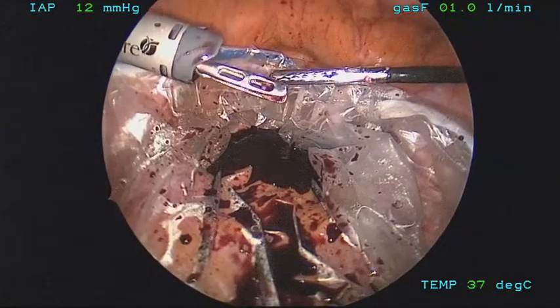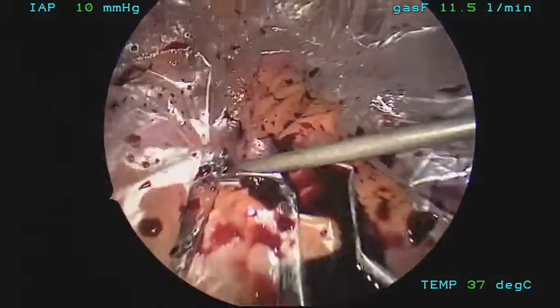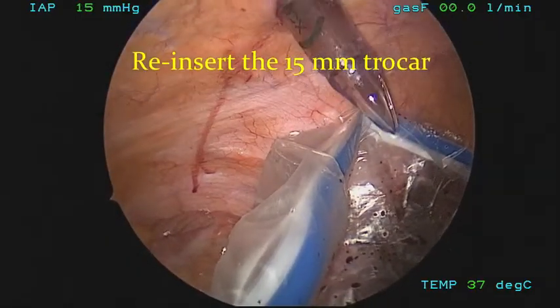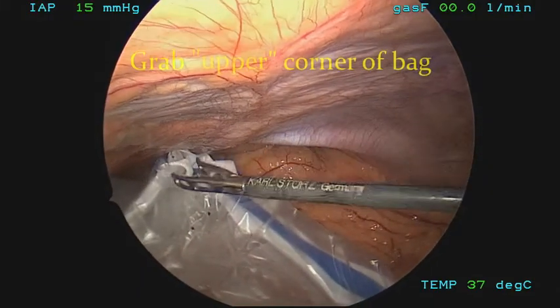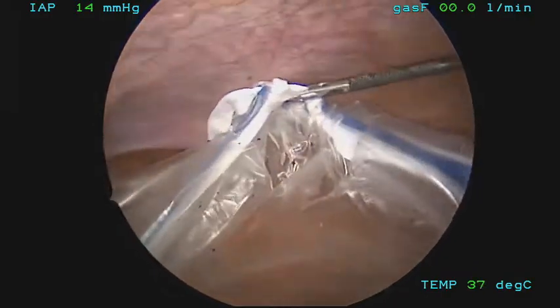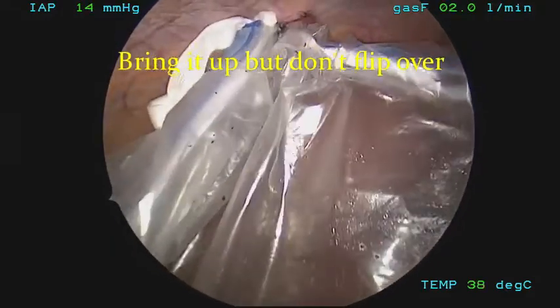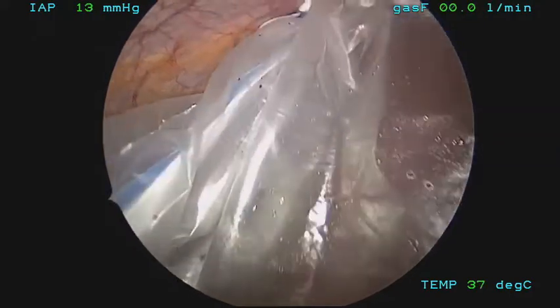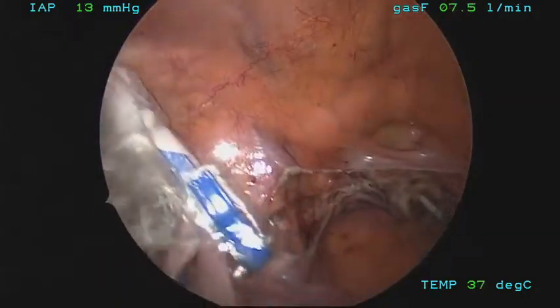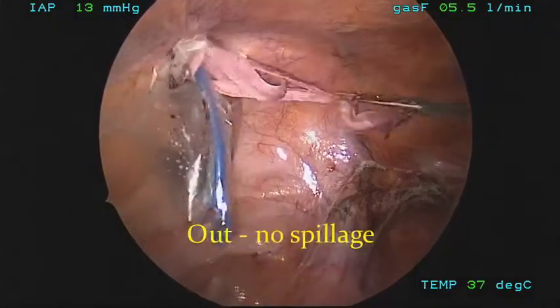The alligator-toothed grasper is excellent for removing tissue because it scoops up some of the tissue inside the scoop. Suction is carefully utilized to remove any debris that can possibly be removed. Gentle surgical technique is always recommended. Now the bag will be grasped at one of the knot ends and brought out. It is important not to flip the bag over during the procedure, keeping the bag upright at all times. An atraumatic grasper is utilized. A 15-millimeter hole is the minimum recommended to be effective in removing the bag intact. The other surgeon or assistant guides the bag to keep it from flipping over as it is brought out. As you can see, the pelvis is quite clean, and any residual blood is trapped inside the bag and will be brought out with the bag.